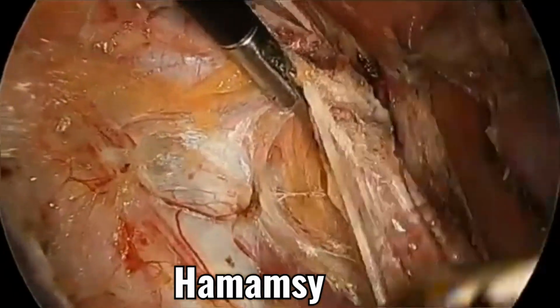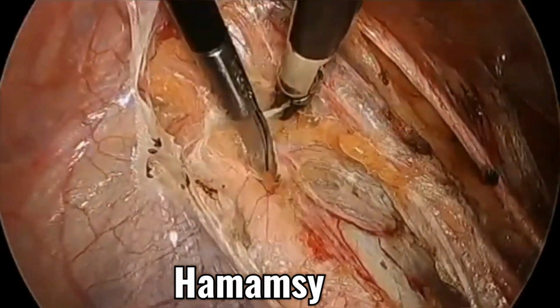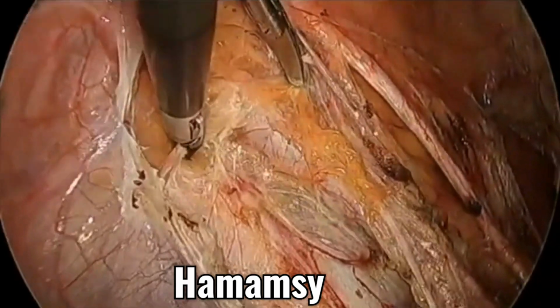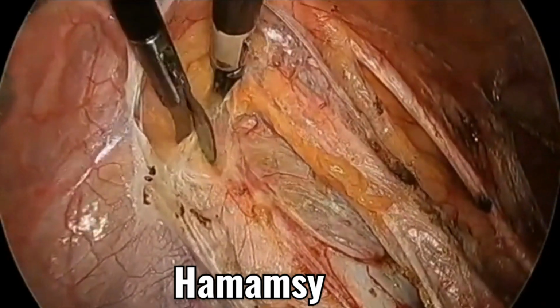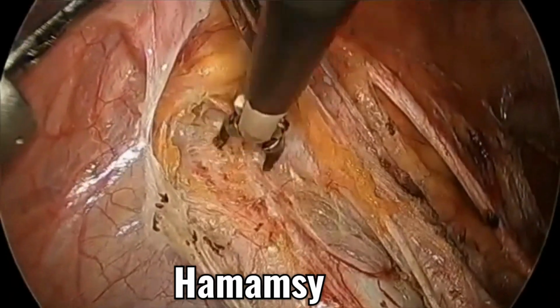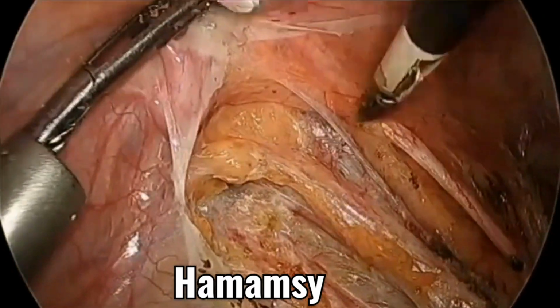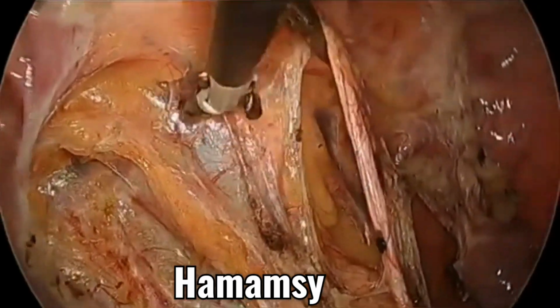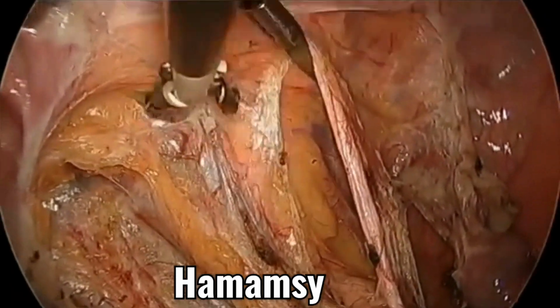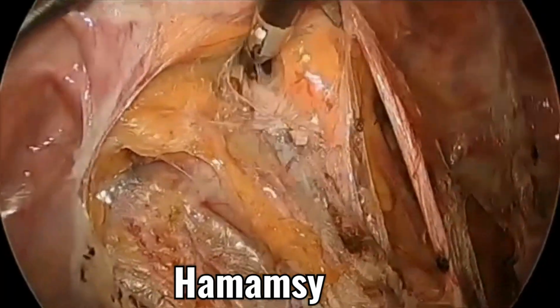Simple bipolar في ناس بتستخدم ليجا شور، في ناس بتستخدم هارمونيك، في ناس بتستخدم مونوبولر. انا كهمامسي كل الناس عارفين شغلي classic surgeon simple surgeon using a classic bipolar simple bipolar against الادفانس bipolar بصراحة في شغل البلفس. You do a natural dissection.